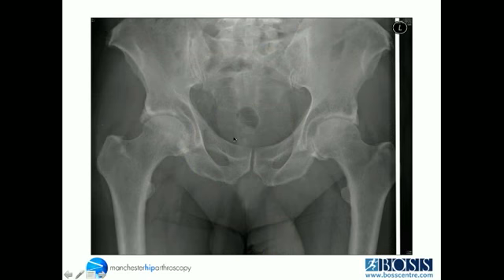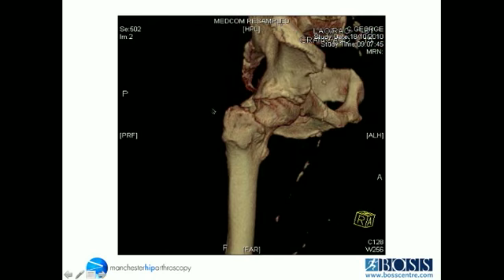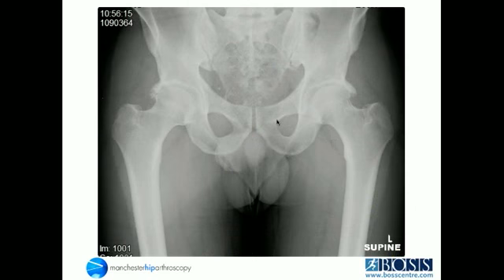This is an older patient in his 50s, and when you look at the x-rays carefully, you can see that his true acetabulum ended there, and this whole region here is ossified bone. And previously this would have been reported by the radiologist showing an osteophyte. What it actually was a grossly ossified labrum. So this whole region here is all abnormal, and he had a mild cam deformity here on the femoral neck. And that's just showing the lateral side, and this all had to be resected.